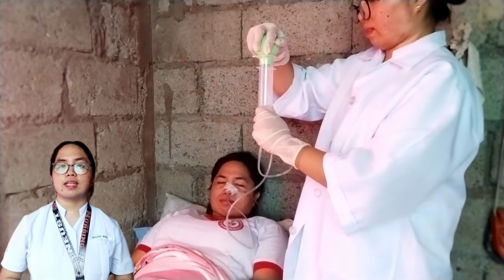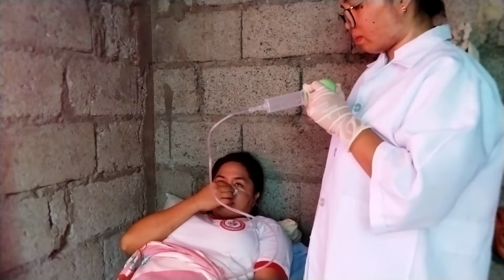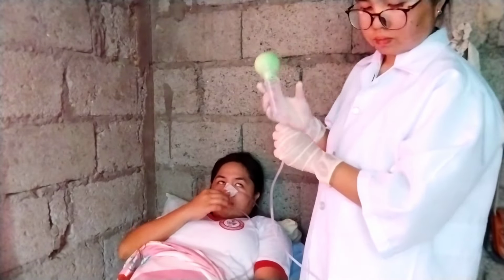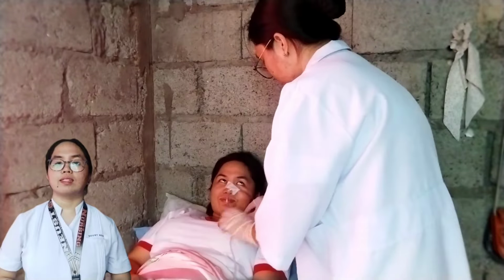Clamp the feeding tube. Clamp the feeding tube before all of the water is instilled. Rationale, clamping prevents air from entering the tube. Ensure client comfort and safety. Secure the tubing to the client's gown. Rationale, this minimizes pulling of the tube, thus preventing discomfort and dislodgement.